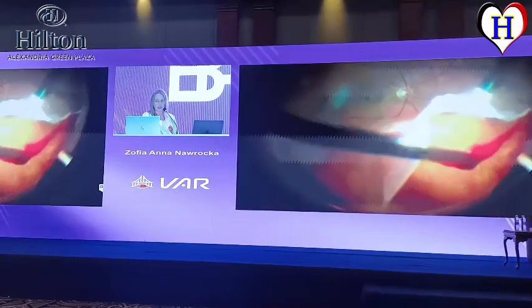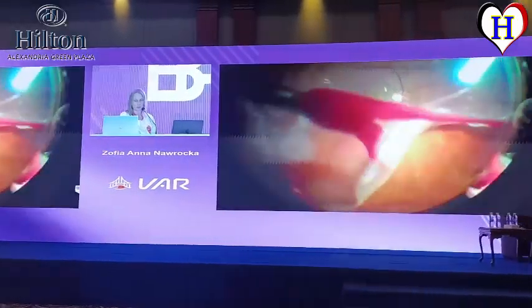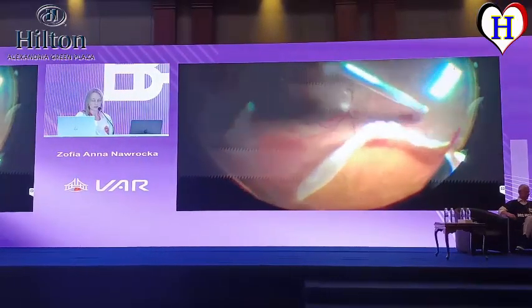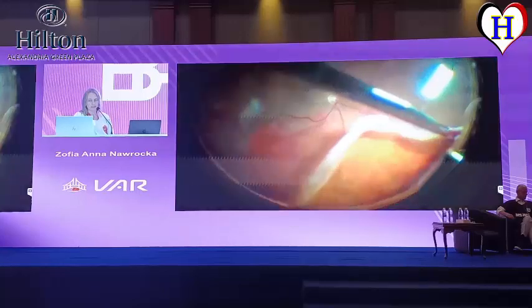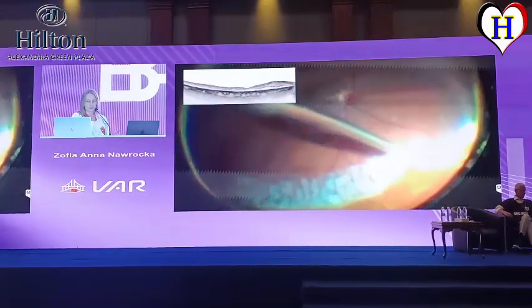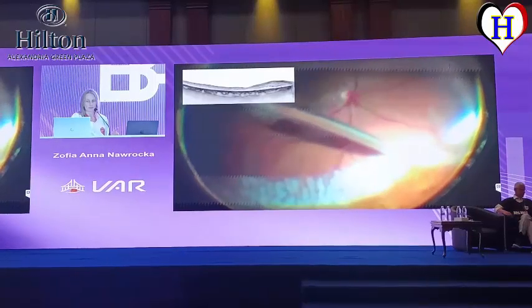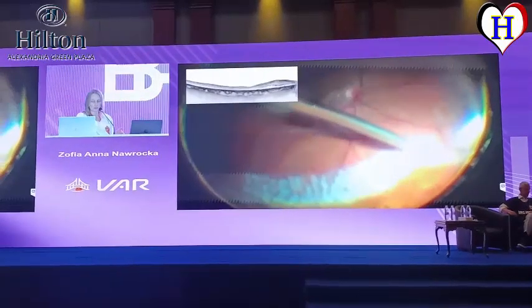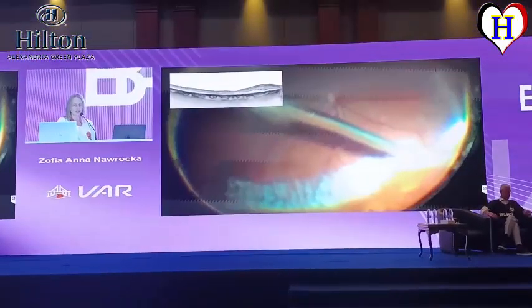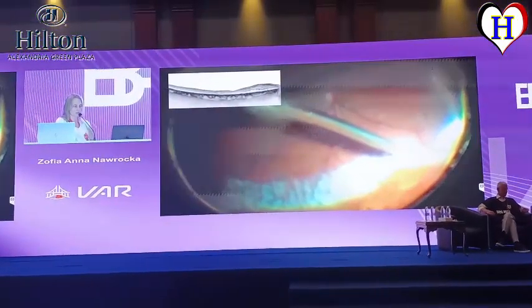You can see that I removed the blood from the subretinal space, and the retinotomy is already created, but still we must think about the fact that afterwards some subretinal bands might be created. So in my opinion, that is like an ideal candidate for future methotrexate use.